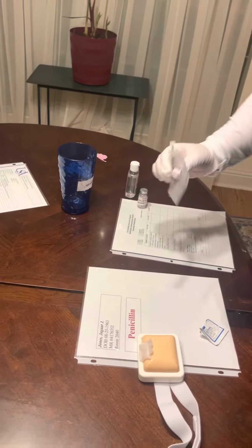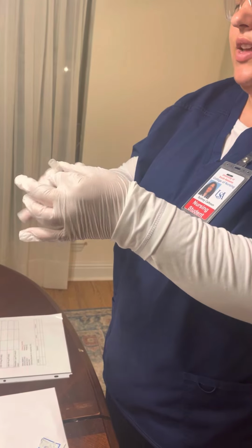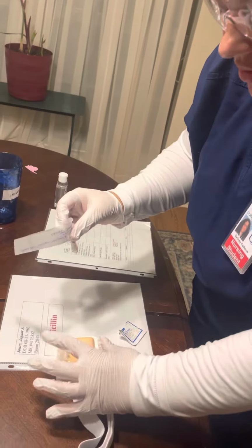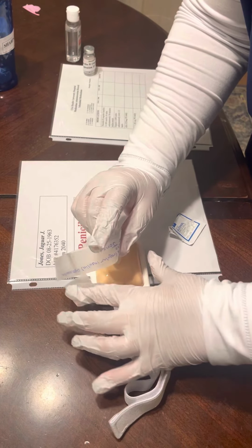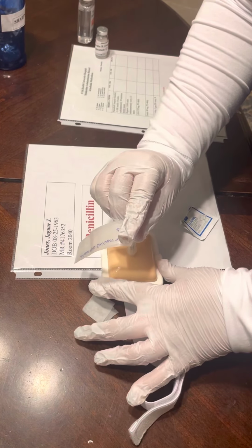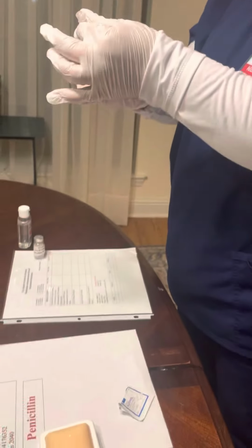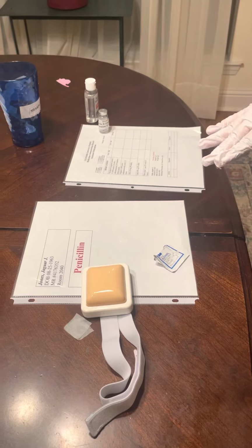All right, I'm gonna take my needle, put down the safety, pinch, do like a dart, go, slowly do the needle, wait a couple seconds, then pull up. I am going to do this. Dispose of it properly. Put my patient down back to the lowest height.